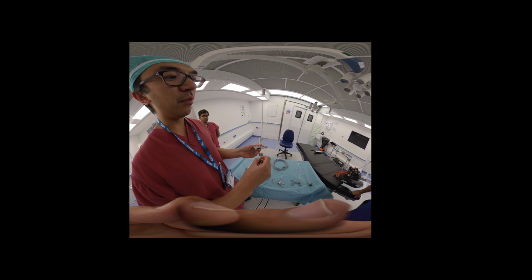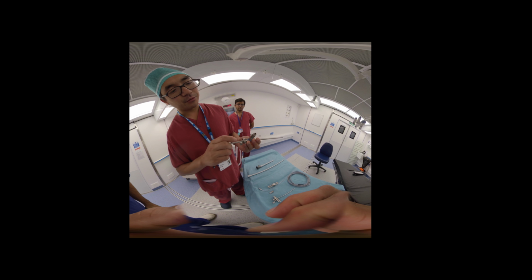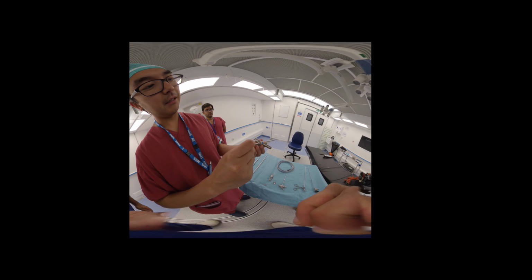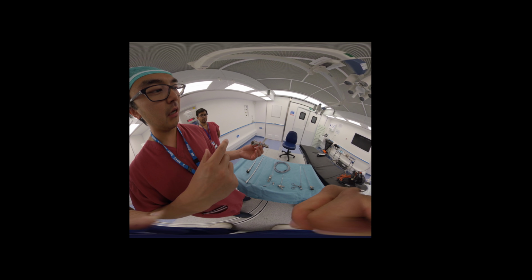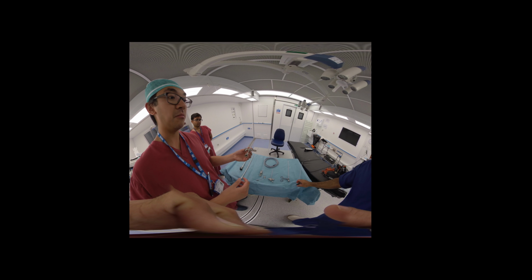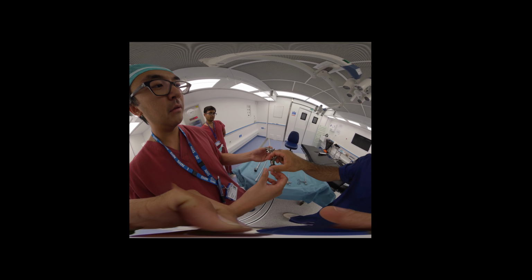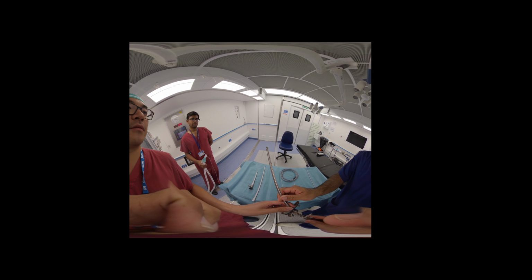Again, this is what you need to attach any instruments. So attach the bridge, tab facing down, and then you just push that on, and it just clicks into place like that. Okay, and then this is the bridge through which you attach your endoscope. Why do you need a bridge? It's actually so that your light, once it's in the bridge, won't go beyond the end of your scope.